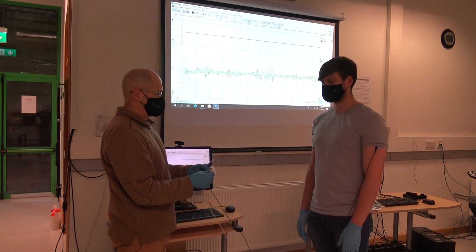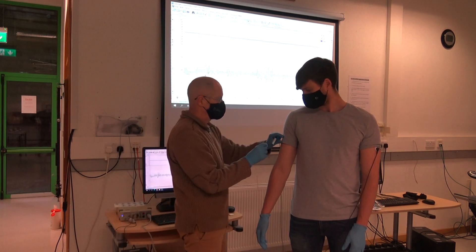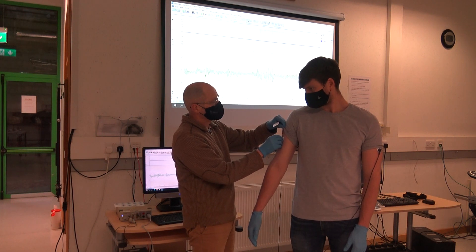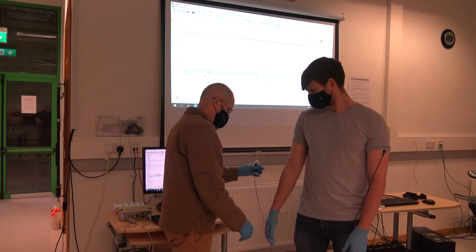Once that's firmly in place we're then going to place the negative white lead on the same position on the upper part of the right arm, again avoiding the major muscle groups on this arm.